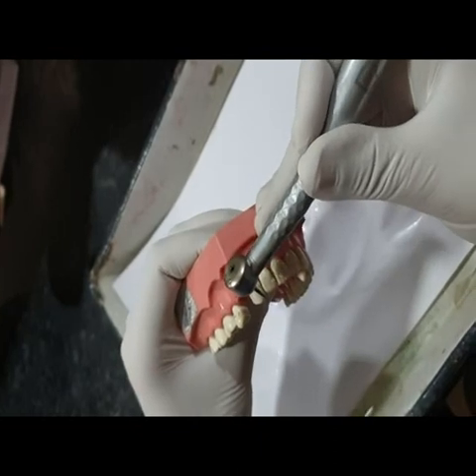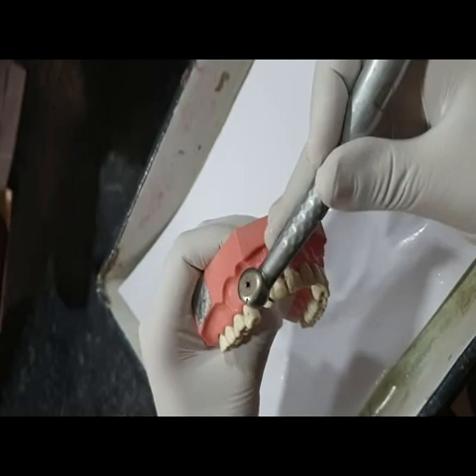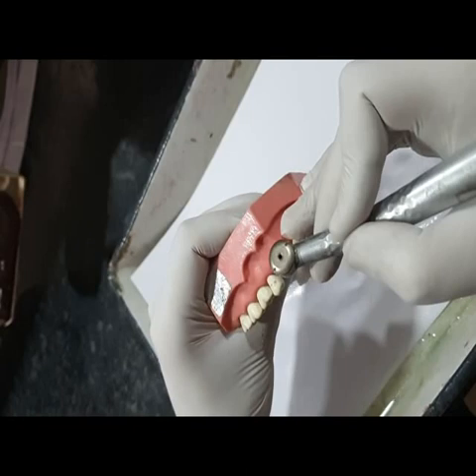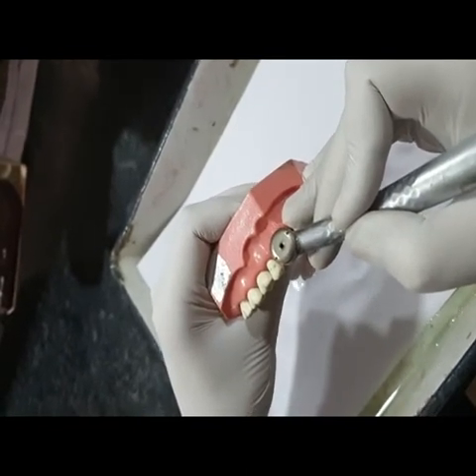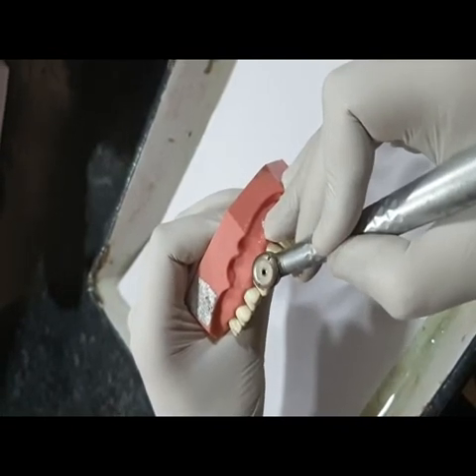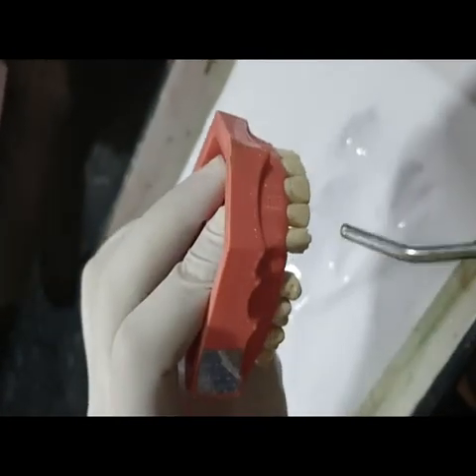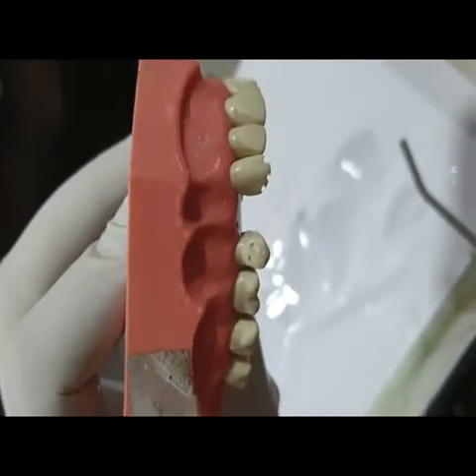First, we have to give depth orientation grooves on both the distal and mesial slopes. While giving them, you have to take half the bur depth inside the tooth structure to get adequate depth of your depth orientation grooves. As you can see here, I have given the depth orientation grooves on the mesial slope as well as on the distal slope.